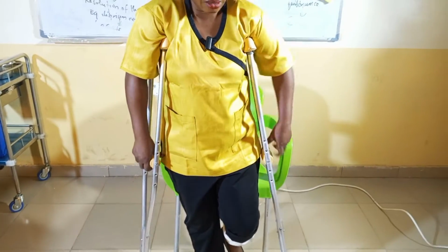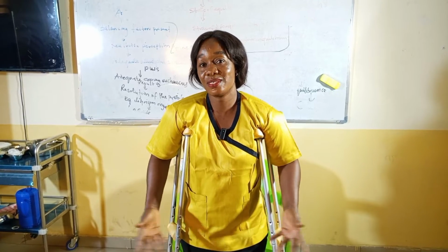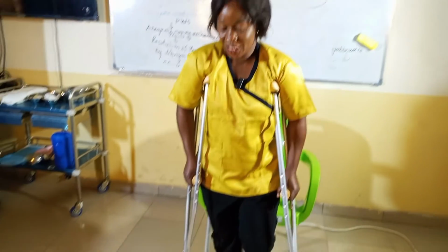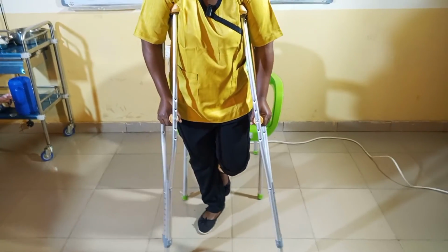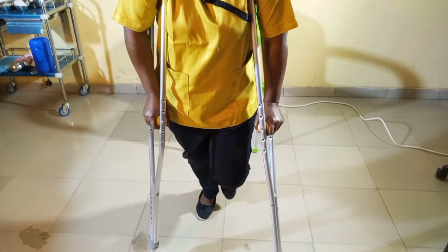Make sure that your armpit is on the shoulder part properly, and your hands are on the handle. So now we have done from sitting to standing. Then since it's no weight bearing, the patient pushes the crutches forward and then jumps and continues.